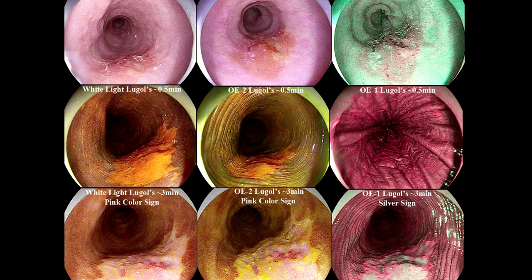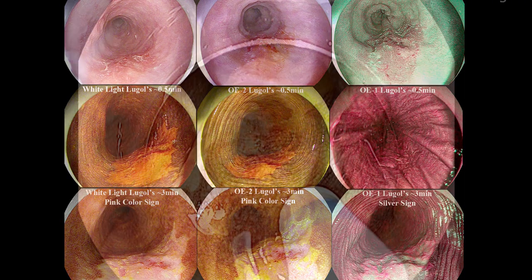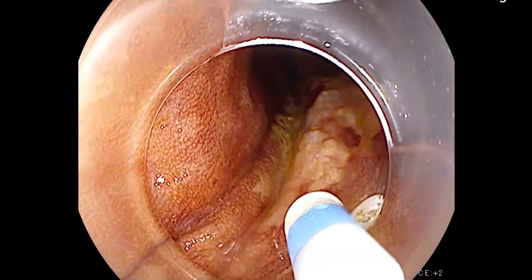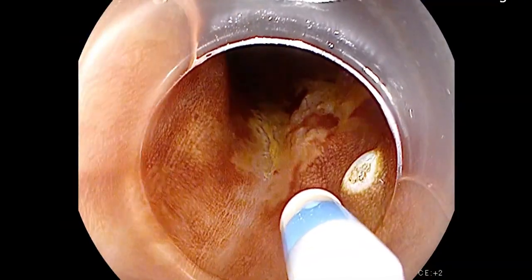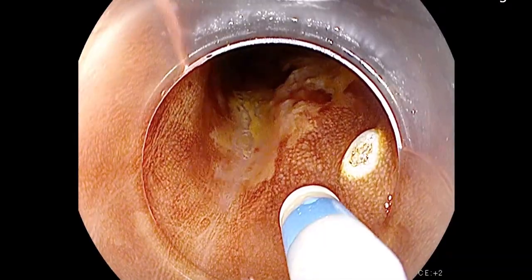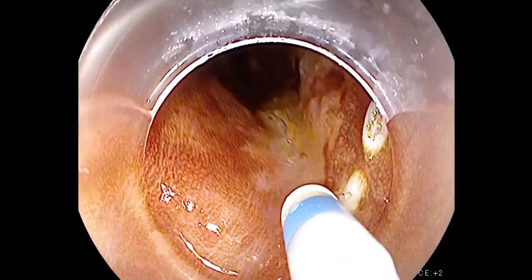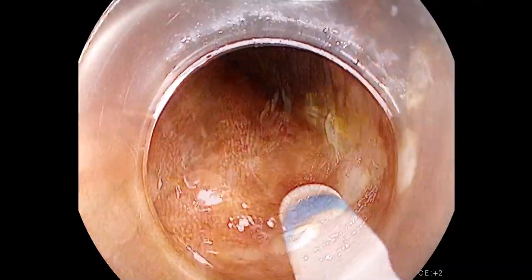Here we can see the various macroscopic findings of squamous cell carcinoma with white light, image-enhanced endoscopy, as well as Lugol's. With the closed tip of the dual knife, the lesion is then marked in preparation for resection.